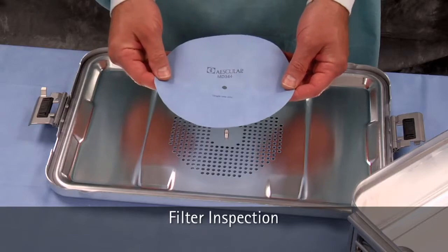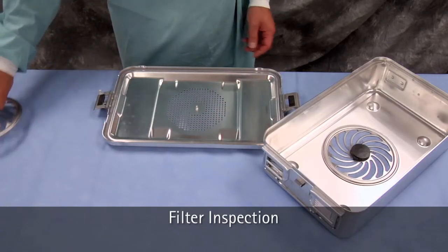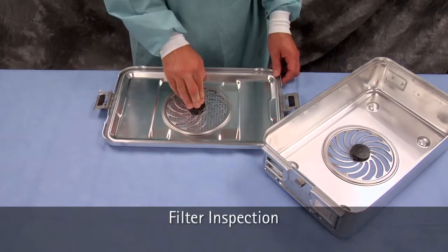If the filter is damaged, you should consider the set not sterile. Discard the single-use disposable filter after checking for integrity.